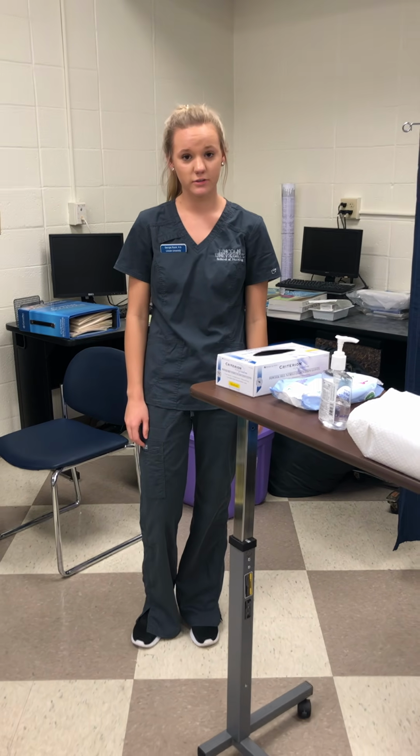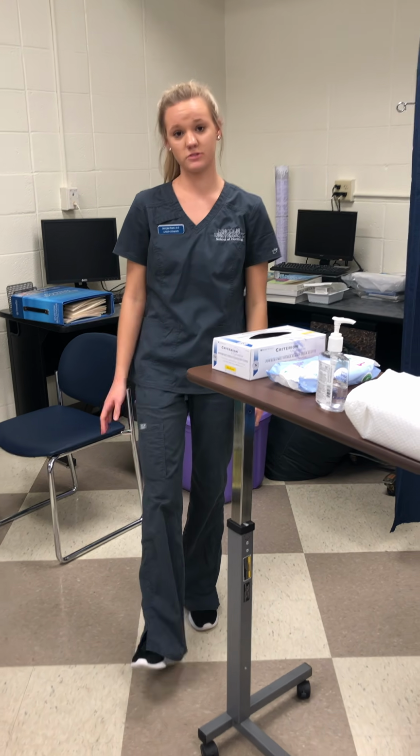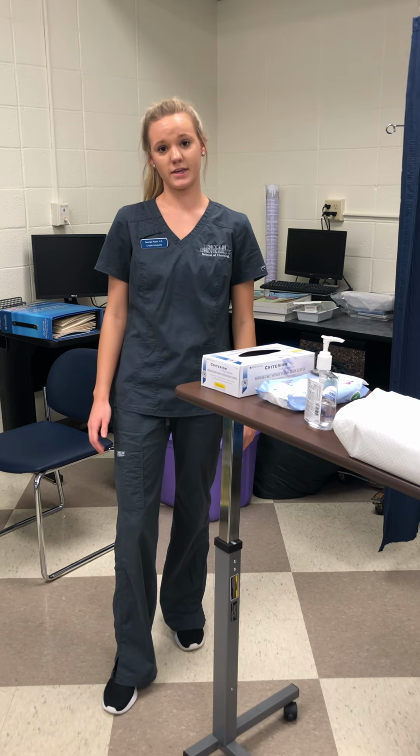Today is September 18th, 2019, and it is 2:45 in the afternoon, and today I will be doing insertion and removal of a Male Foley catheter.